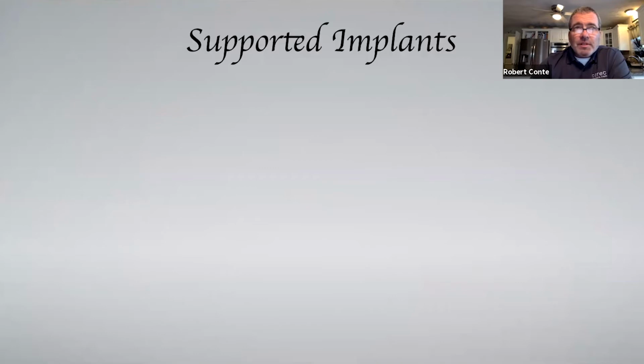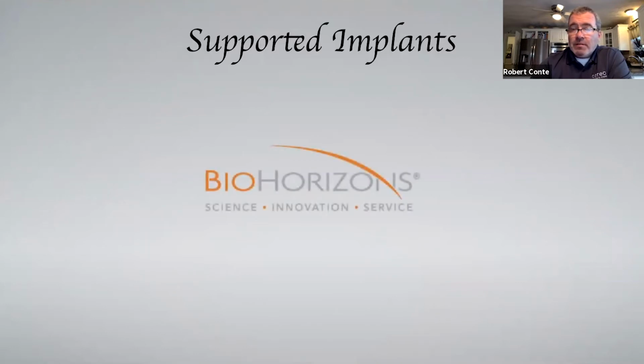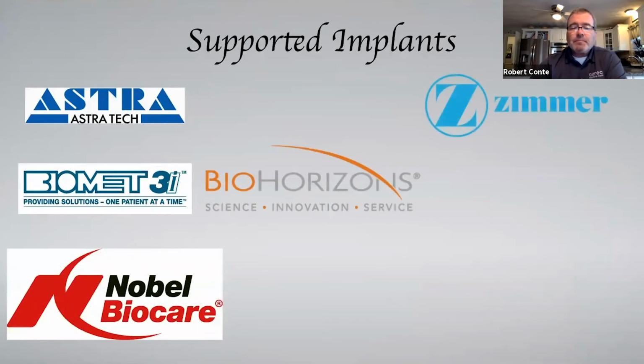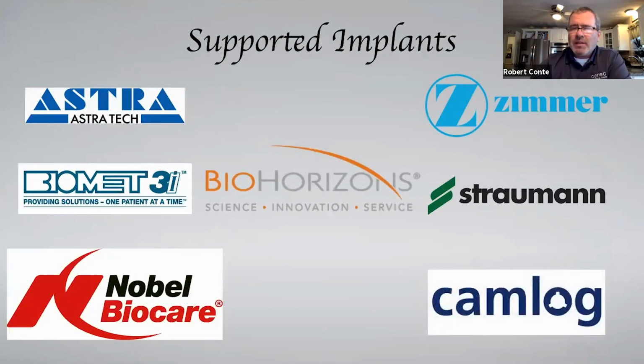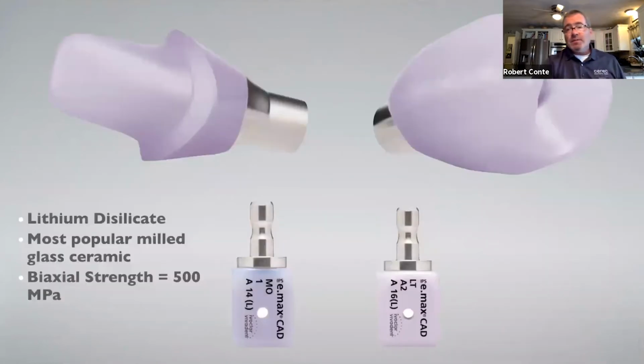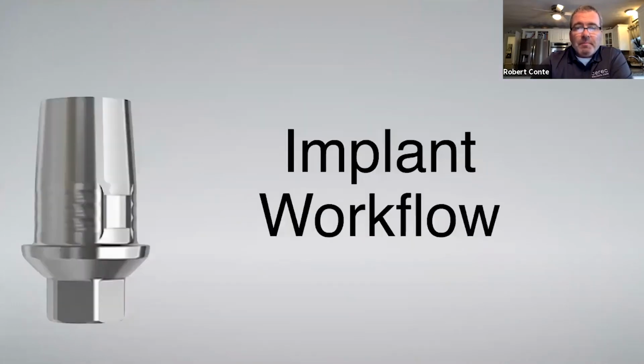The systems that are presently in the software are all the big guys, from BioHorizons, Astra, 3i, Zimmer, Nobel, Straumann, Camlog, as well as several of, I want to call them knockoffs, but the secondary implant companies that are compatible with these. You can still use their systems. So in the last several years, we've come up with a zirconia abutment. You don't have the ability to create a screw retained crown at this time out of zirconia. So whether it's zirconia or Emax, again, the system is the same.